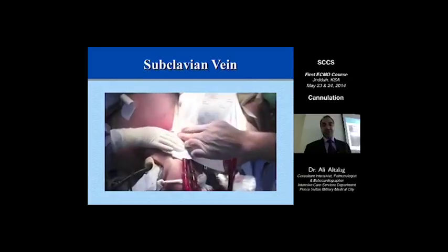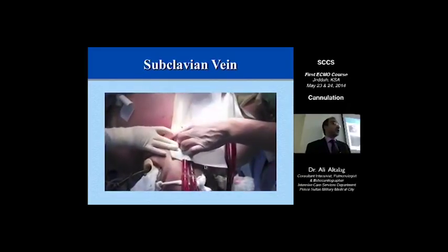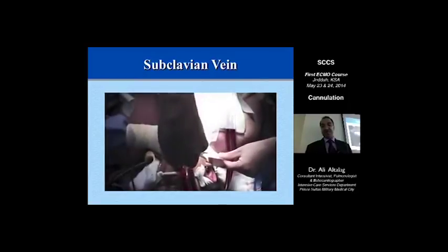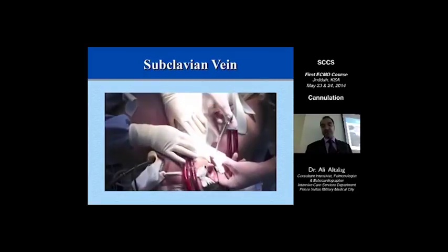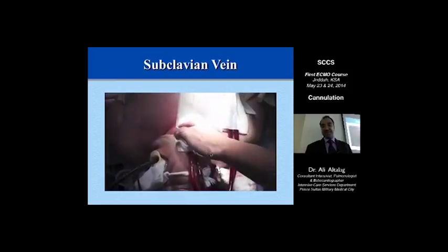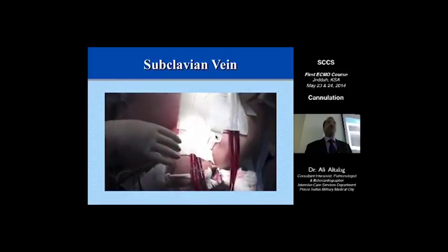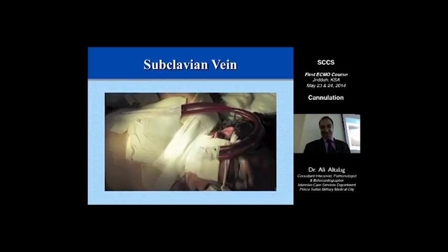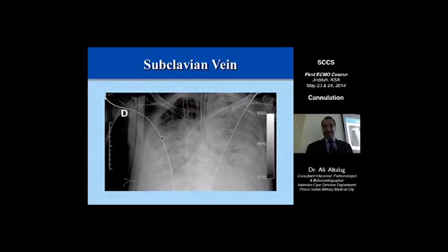So now the catheter is sutured into the skin. It's fixed with multiple long plasters. See the surgeon? He's doing the work himself. I don't know that Dr. Aziz does that. You do it, right? So this is how it ended up, and you see the cannula is going all the way through in the chest x-ray.